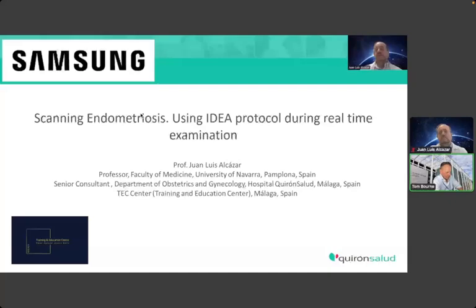It's a pleasure to be with you today to talk about a quite interesting topic. Particularly, we are going to talk about scanning for endometriosis by ultrasound using the IDEA protocol during the real-time examination.